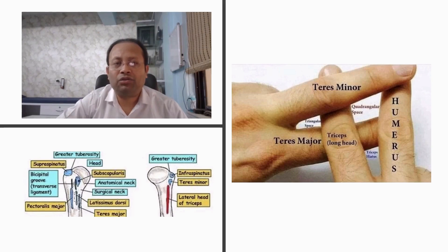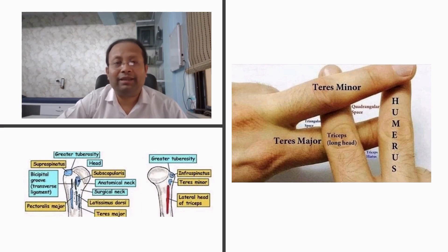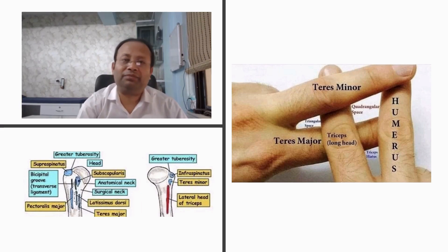The landmarks which are important in locating the quadrangular space are the upper end of the humerus, the triceps long head, teres minor, and teres major.